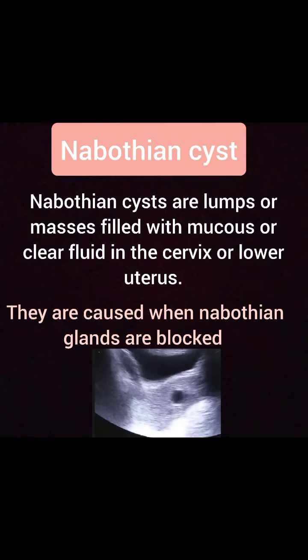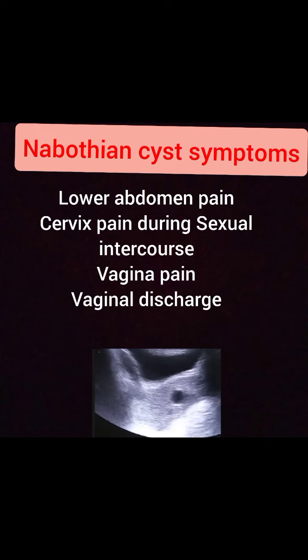So this is the case of Nabothian cyst of the cervical canal or lower uterus. You can see those anechoic black structures in the lower uterus.